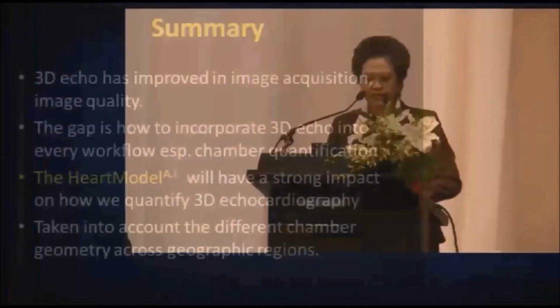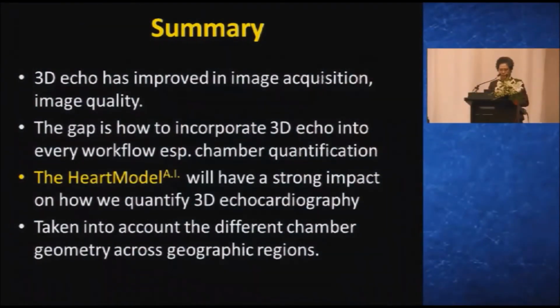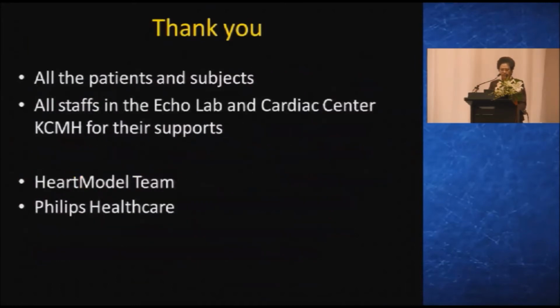It's like you're seeing your child beginning to take the first step into the world. And in summary, I think that 3D echo has improved in image acquisition and image quality, but the gap is how to incorporate it into every workflow. And I think the HeartModel will have a strong impact on how we quantify 3D echo, and it has taken into account the different chamber geometry across geographic regions.